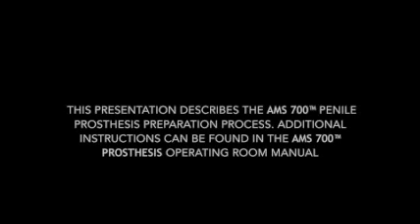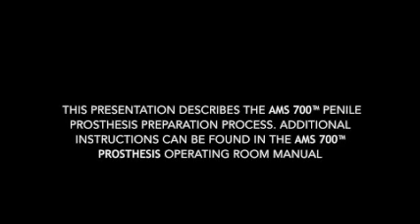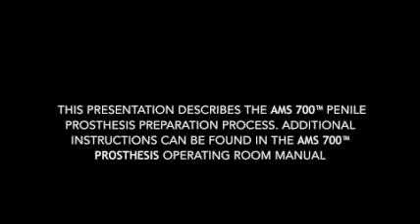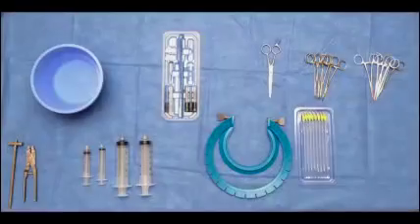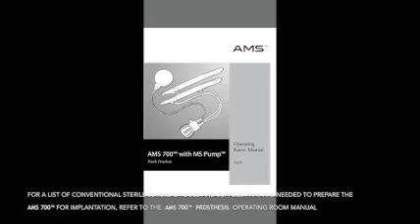This presentation describes the AMS 700 penile prosthesis preparation process. Additional instructions can be found in the AMS 700 prosthesis operating room manual. For a list of the conventional sterile surgical tools and supplies that are needed to prepare the AMS 700 for implantation, refer to the AMS 700 OR manual.